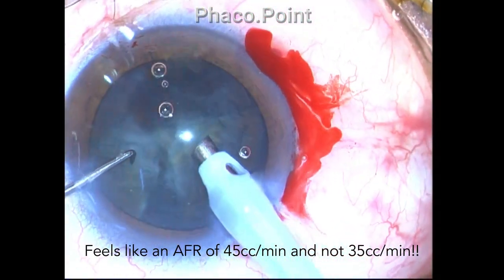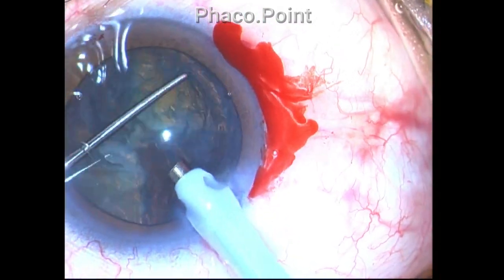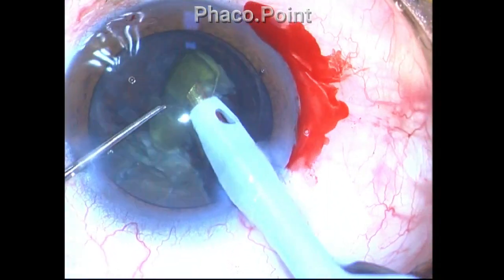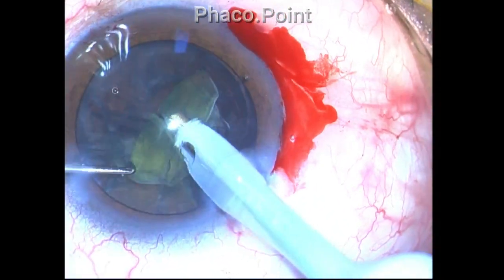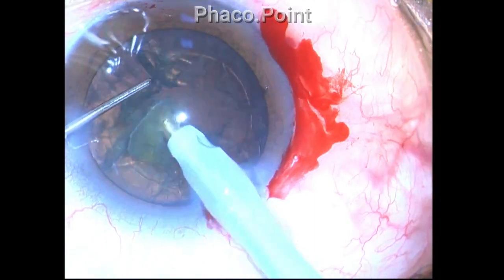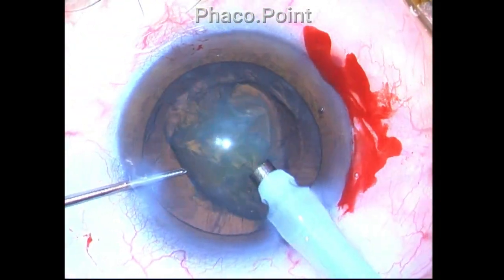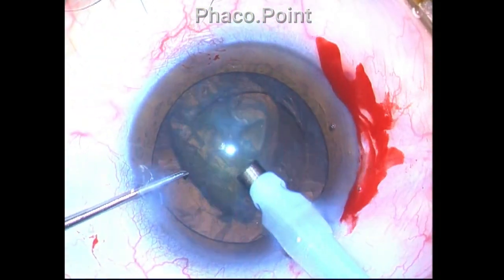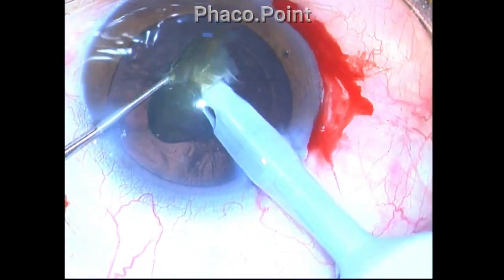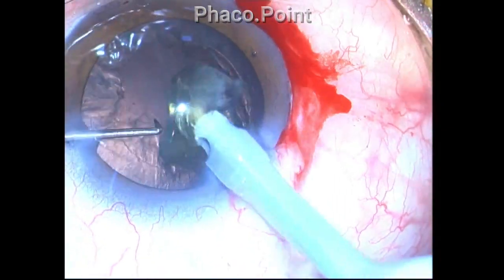He is not excessively moving the phaco tip around or waving it around, but in spite of this there is a magnetic followability of the pieces that simply seem to disappear into the phaco tip. There is also a great deal less chatter, and the nucleus fragment seems to remain almost stuck to the phaco tip.